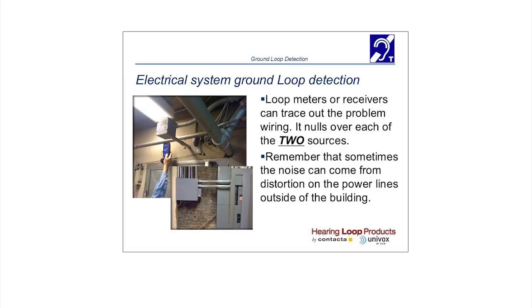I always recommend, I have a little quick story here about an audiologist who decided to rent a facility that was very inexpensive. And I couldn't figure out why till I went, and I noticed the major high kVA lines for the whole city ran over their building. Their computers didn't work, nothing worked within their facility. It was a mess. They weren't in there very long, thank goodness.